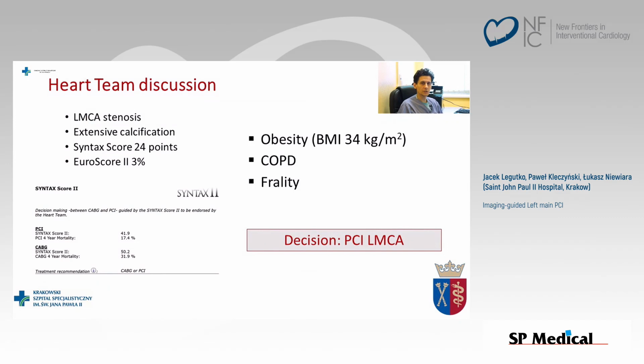During the heart team discussion, this patient was considered to have left main coronary stenosis with extensive calcification and a SYNTAX score of 24 points. The treatment recommendation from SYNTAX 2 was coronary artery bypass graft or PCI. However, considering obesity, COPD and frailty, this patient was referred for PCI of the left main.